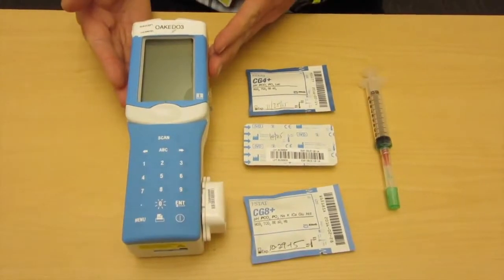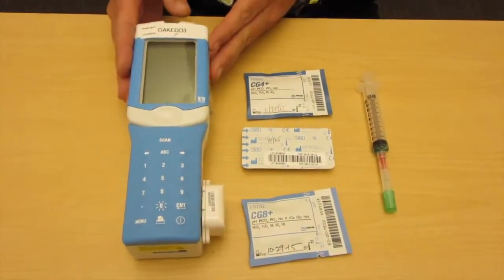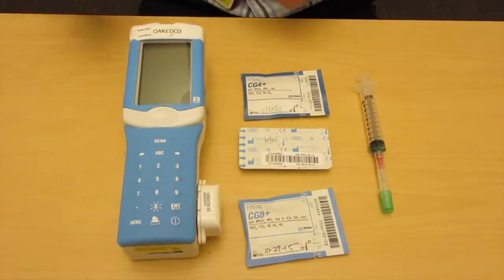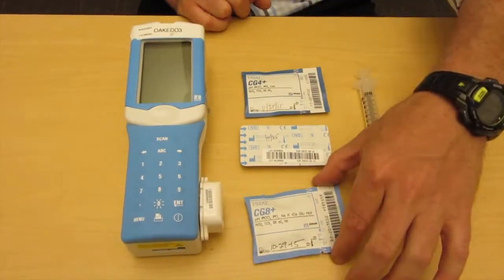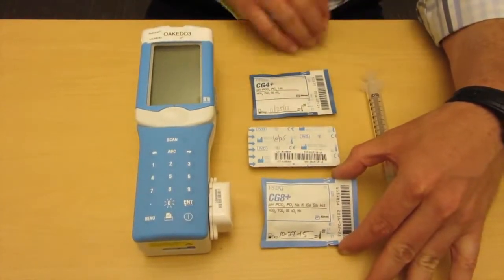We're going to do a quick orientation to the iStat, which we use all the time for point of care testing at the bedside here in Kaiser Oakland ED. Essentially we have three things that we can use with it. We can do the CG8 cartridge, which is our comprehensive — it does a full chemistry, an H&H, plus a gas, either venous or arterial.